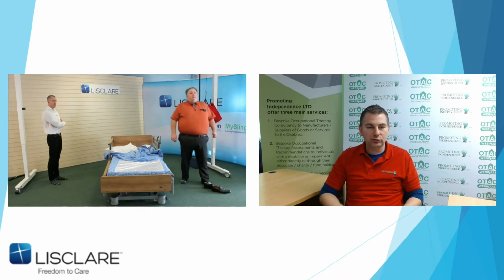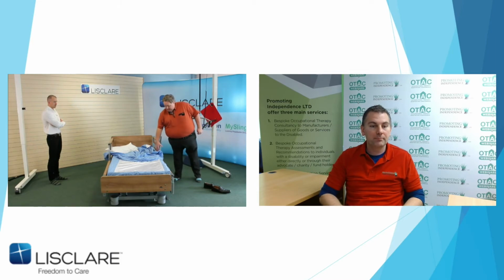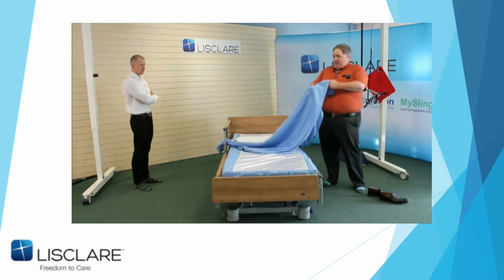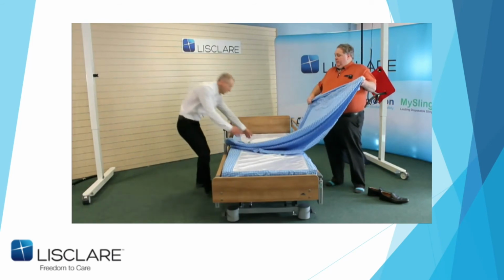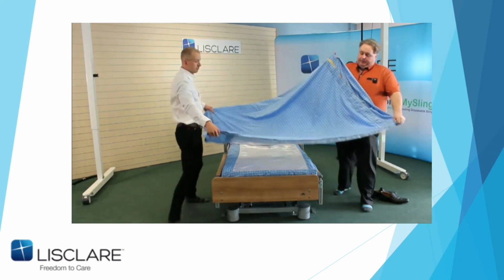We've got a question around the sheets. It looks like you're using them widthways. Is there a reason for that, or should they be used lengthways, or are they designed to be used exactly? There is a particular reason for that. This is the biggest learning curve that I had. John, you and I will show this. Just so you can see this, just drop that sheet down.